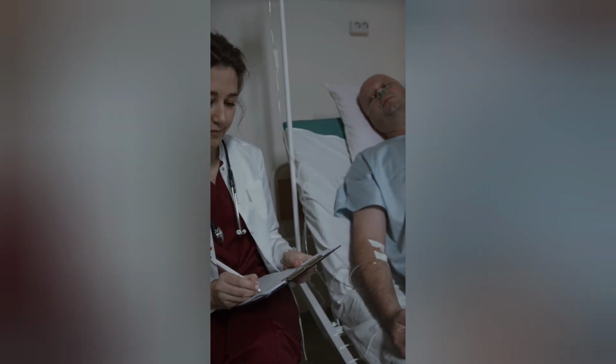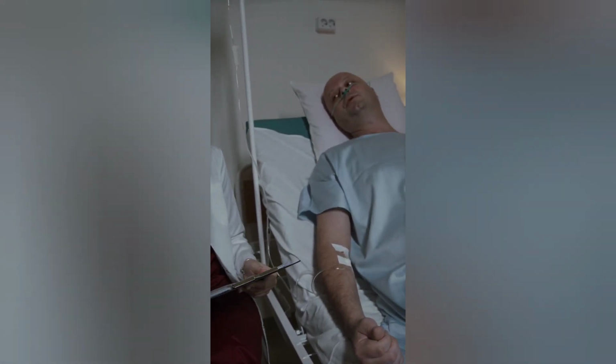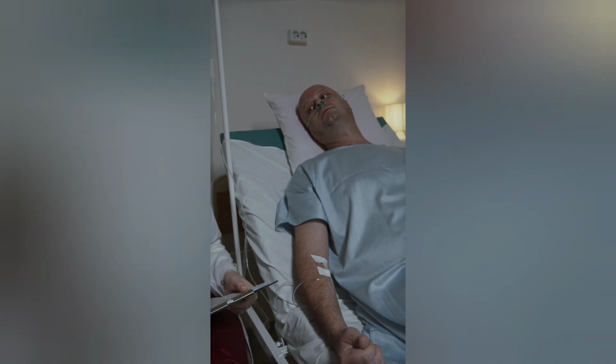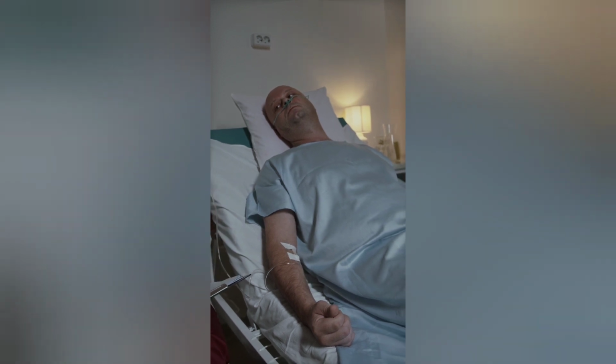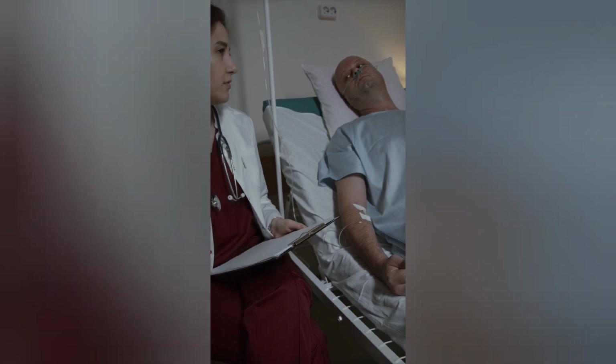Introduction and preparation. Introduce yourself to the patient. Confirm the patient's identity. Explain the procedure to the patient. Ensure the availability and proper functioning of oxygen equipment.